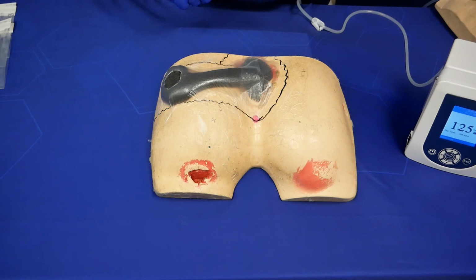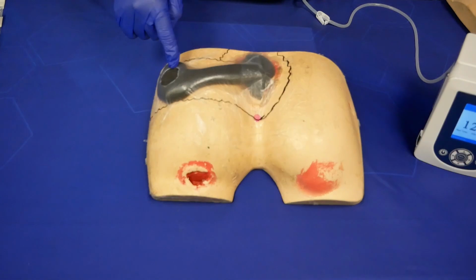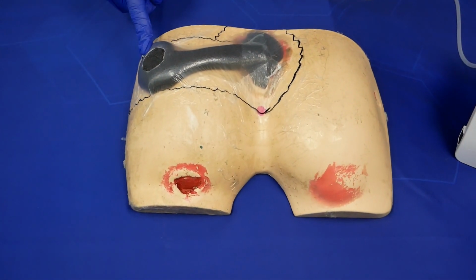On this coccygeal wound, you can see that the black foam travels from the point of where the wound location is over to this person's left hip. This is achieved by using one piece of foam. There's one piece of foam on the inside of the wound, and this is one continual piece to make the bridge. So we have the bridge and a landing spot for our port pad.